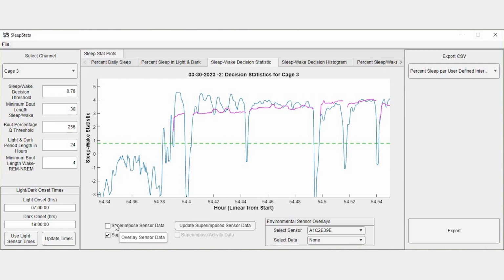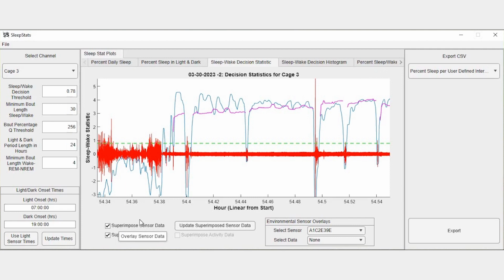Now, let's add the sensor signal. This time scale is too big to observe the cycle variations from breathing. However, the breath rate estimates effectively quantify these over 2-second intervals. We can also see some artifacts at a transition between wake and sleep where a short activity burst included in the estimate window interferes with the estimation, generating a suddenly low value.